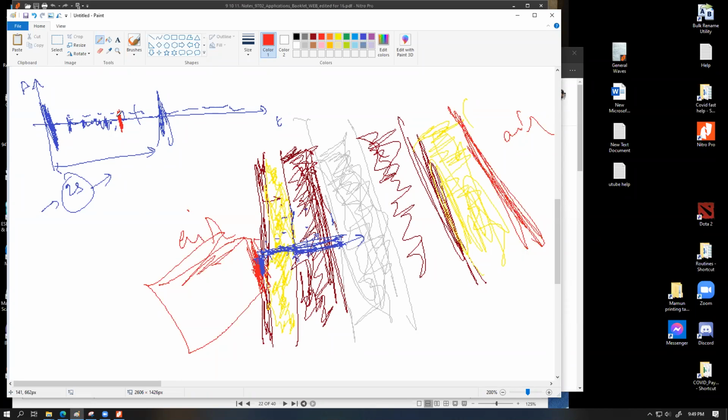One is how much intensity we received for the reflection, and how late this reflection was received from the sending point. So the value of the intensity tells us how hard or soft the reflection is. That duration tells us how far away it is located. We have to use both of these pieces of information together to produce that image.